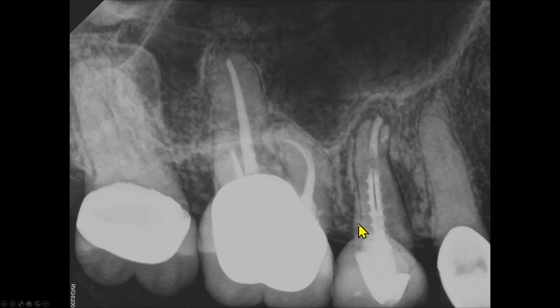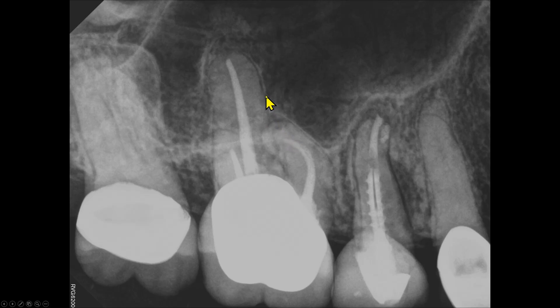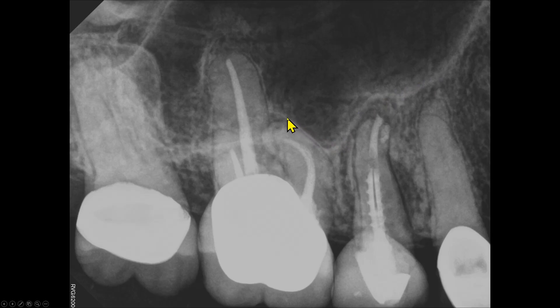As we go distally, we see probable radiolucency around the apex of the mesiobuccal root of the first molar. The apical periodontal space of the palatal root is not very well defined. That's the floor of the maxillary sinus here.